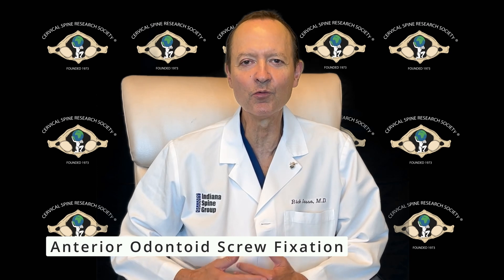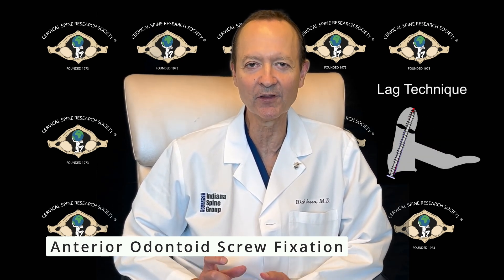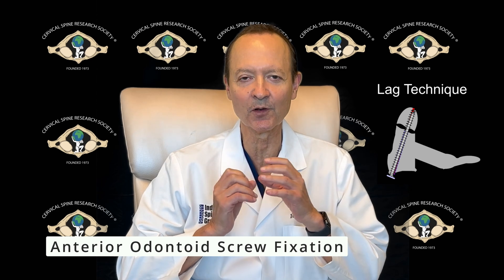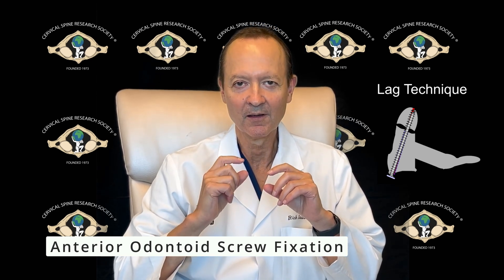Before we start, I'd like to talk a little bit about the controversies. We're going to show you one way of doing anterior odontoid screw fixation — a lag technique with a fully threaded screw setting up the C2 body and odontoid in a lag situation, so that we over-drill the body part, tap the odontoid fractured piece, and then as we place our fully threaded screw, it will slide through the body through the gliding hole and then engage the odontoid tip, pulling it into the C2 body to get a lag effect.